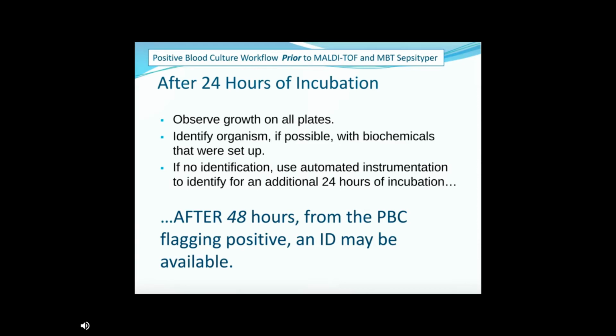If we weren't, then we would have to go to our automated instrumentation, and chances are that's going to take us another 24 hours for the automated instrumentation to give us an identification. Sometimes it takes a little bit longer depending on the organism. So looking at this from start to finish prior to MALDI, we're looking at about 48 hours until we get any type of identification.